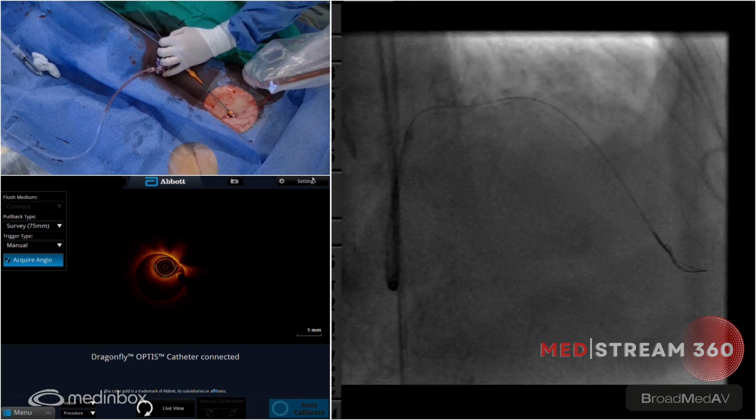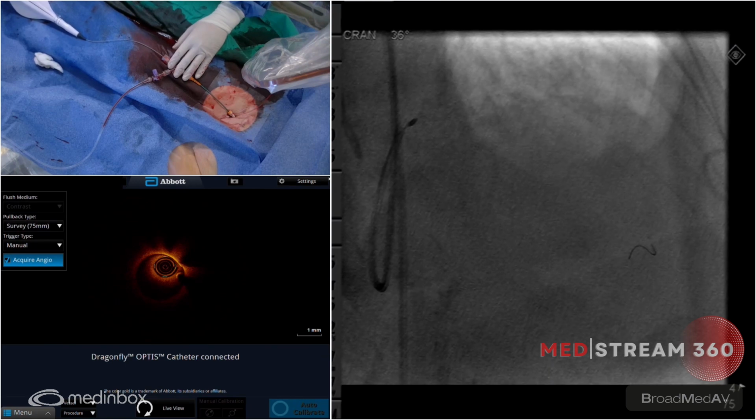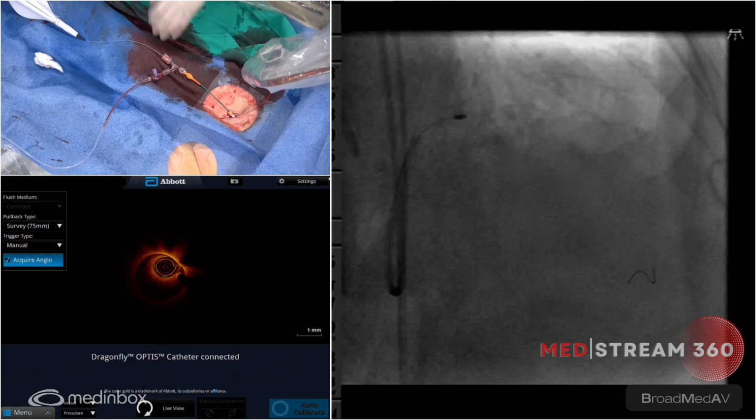Okay, can we get some flush on this thing and I'll pull this out. Okay. Tolerated pretty good. Very little decel there. Yeah, short passes. That was beautiful. That's how to do it. You don't want to rush it. You can see there's probably two nodules there, one in the beginning and one of the bigger ones right after. And I think the burr just got engaged in the second one. So we'll see if I can burr through that one. There you go.